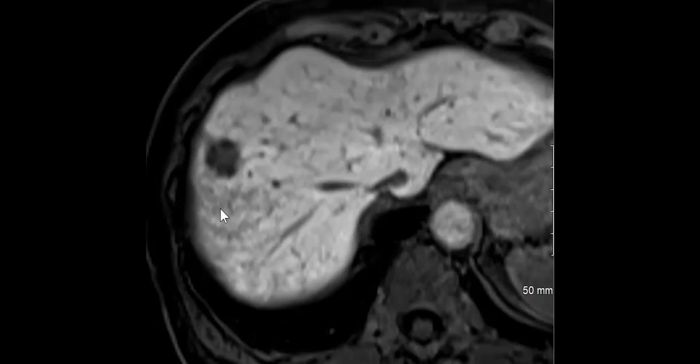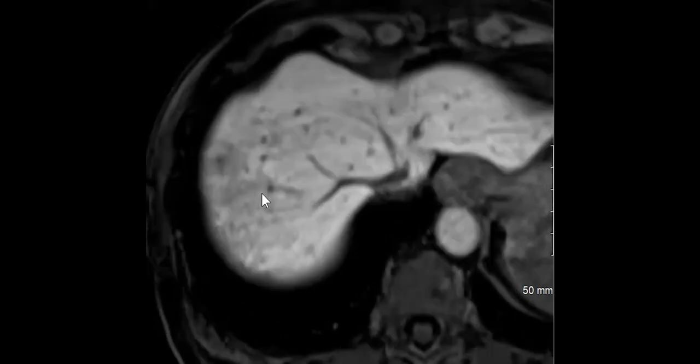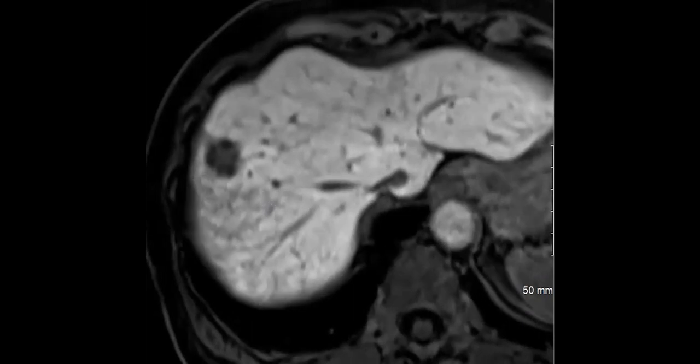The interesting part is that I just got an email from pathologists, and so they resected the patient. They went to the OR, that's about 2 months since the scan, and the tumor on pathology is 8 centimeters. So they called me and they're like, is it possible that this is not the same lesion? Like they showed me the pictures, it does measure 8 centimeters. And I showed them the picture, I'm like, this is a spherical lesion, 2 centimeters in diameter, really nothing else. So this tumor really has grown in less than 2 months, from 2 centimeters to about 8 centimeters, which is unfortunate.